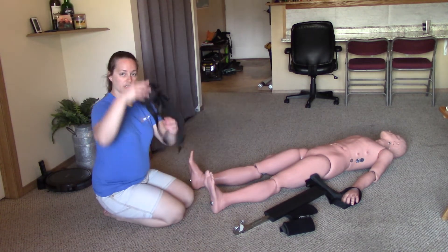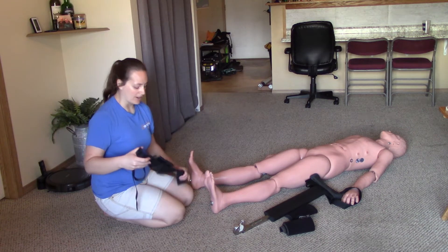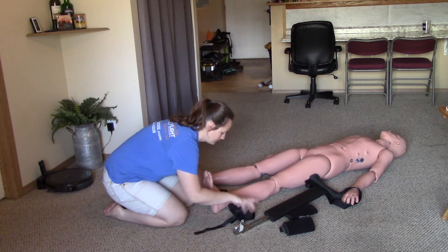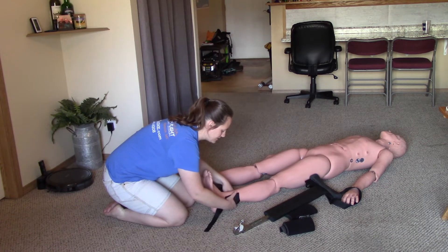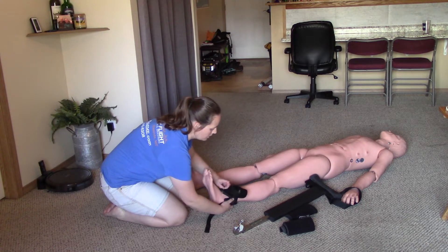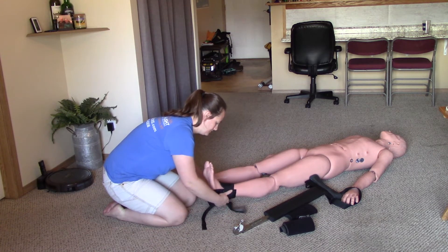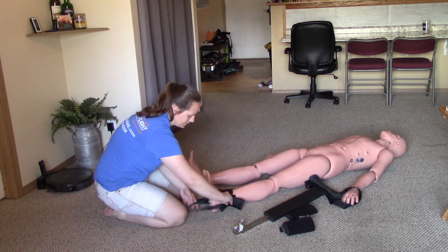I'll now apply the ankle hitch. With a femur fracture, we really don't want to move the leg at all, so we'll slide the ankle hitch up under the ankle. It's tricky on carpet with the Velcro, but keeping your hand underneath helps. Make sure to wrap the Velcro all the way around. The little padded pieces can fold out of the way to make it larger or smaller to fit the appropriate ankle. Go ahead and have the stirrup extended out to make it easier to attach the splint.